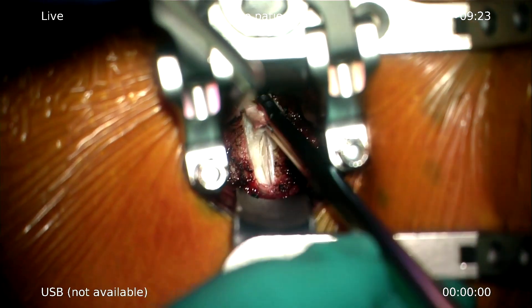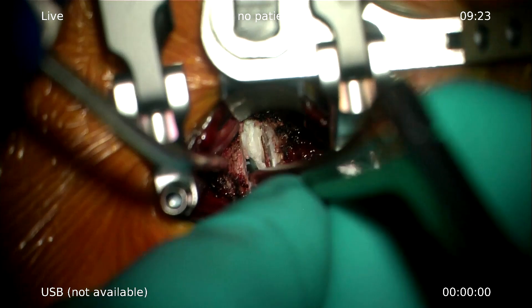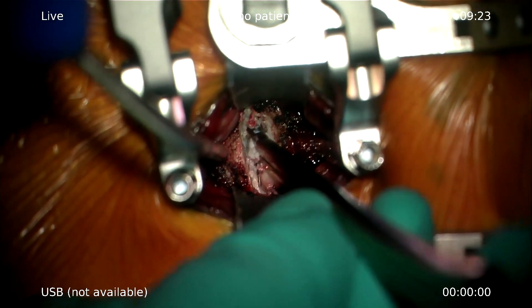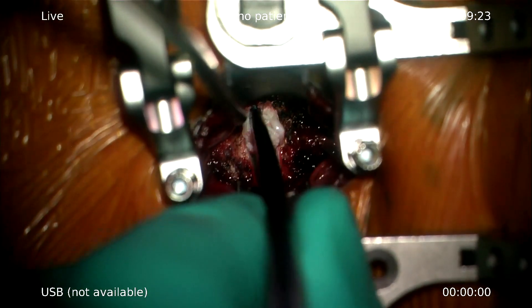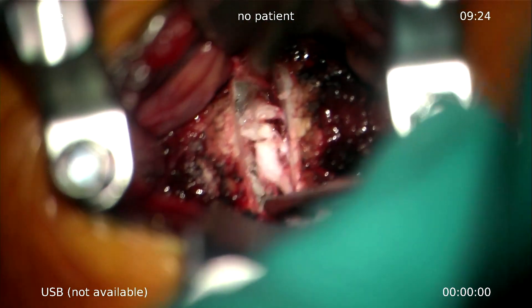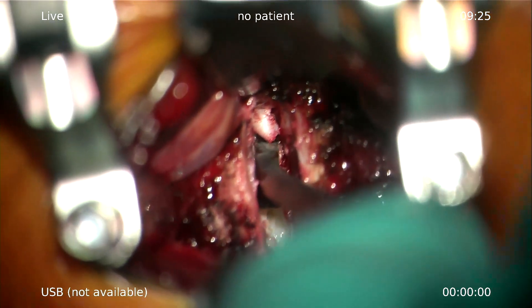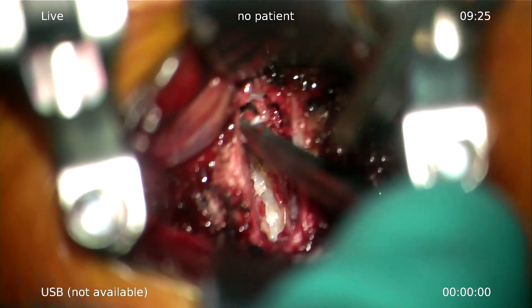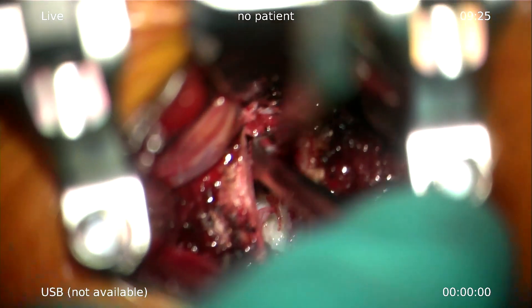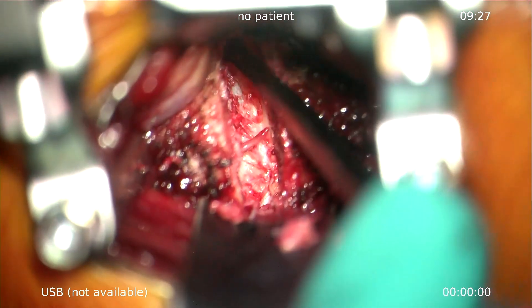After taking out the anterior annulus, you can see that the disc space is opening up. You can also use curettes or sharp spoons to take out the disc from endplate to endplate. I always clean the endplate immediately for bony ingrowth and good stability. You need to take out all the material even if there's no compression posteriorly, to place the TDR in a proper way.